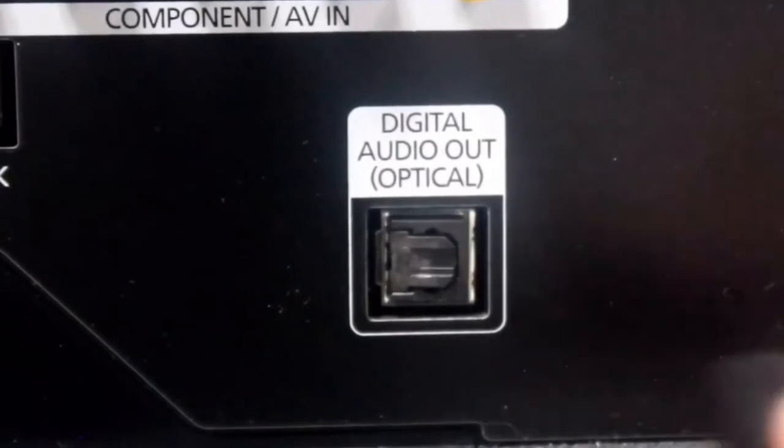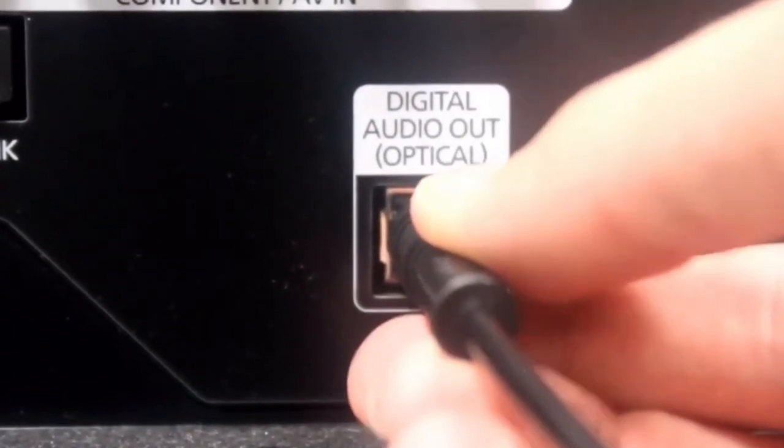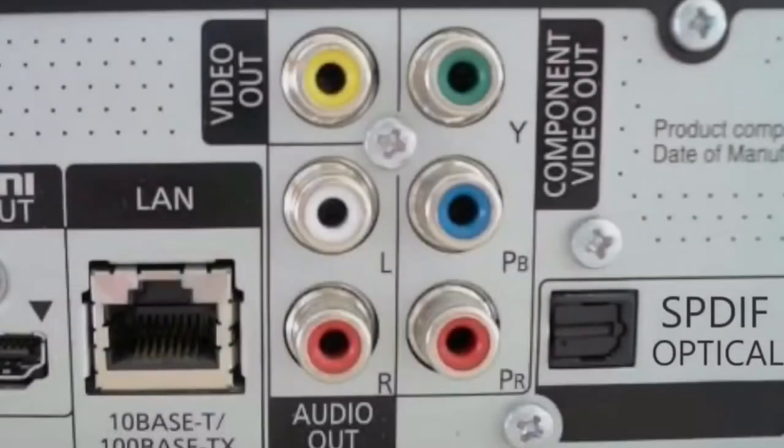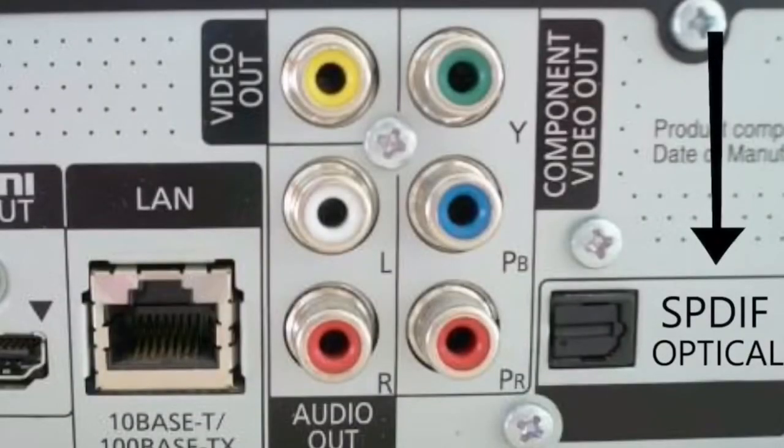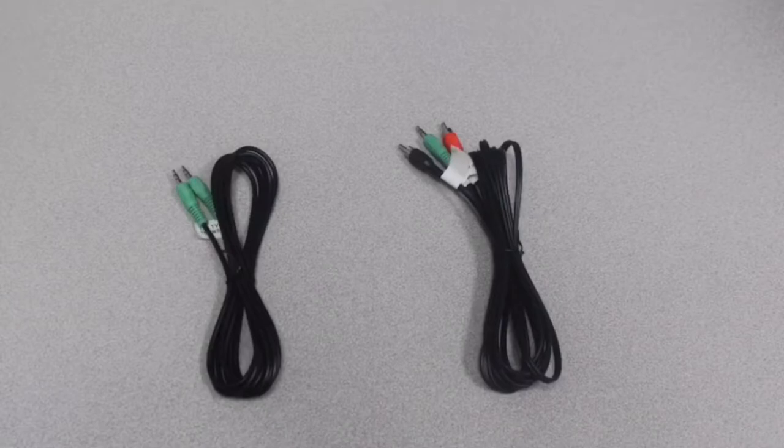The other end of the audio cord plugs into the back of the television. The port is labeled either as digital audio out, optical audio out, or rarely it might be called SPDIF. Just like before, it only fits in one way. Once the optical cord is connected, you will not need any of the other wires.